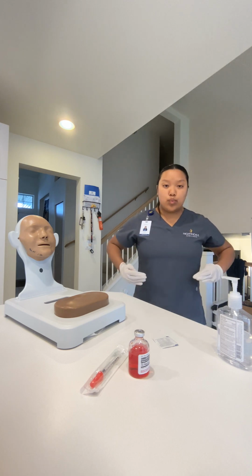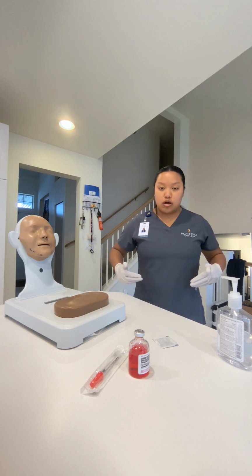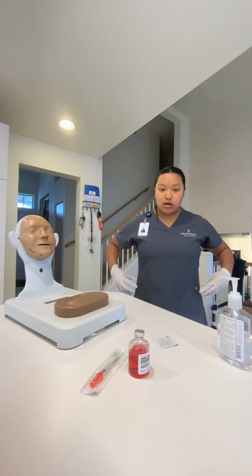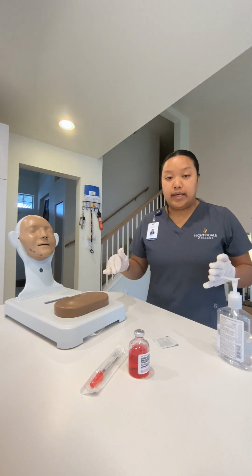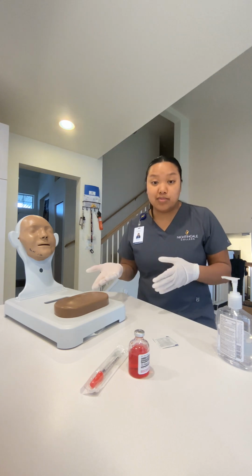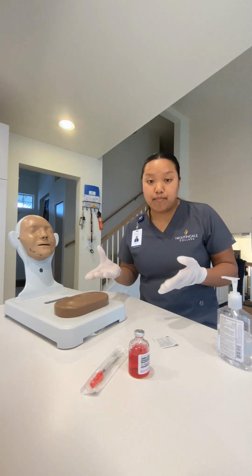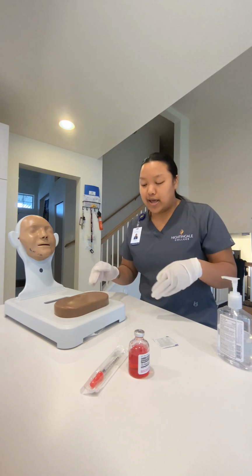And then you want to go right below the costal areas, so you don't want to be on your ribs trying to inject this. You want to be on the sides right here. And that's where I'll be assessing her. So for example, I'll just use her left side, her left abdomen area right here, okay? So I'm gonna assess her abdomen area while that is drying.